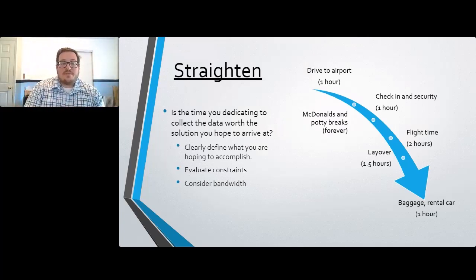So you have to make a couple considerations. One, clearly define what you're hoping to accomplish. If you're doing a cost analysis of replacing this type of instrument, one that we'd commonly see was instruments with delicate TC inserts, especially like an Adson forceps. We were sending them out for repairs so frequently that it became more cost effective to just purchase new ones based on a routine kind of framework.